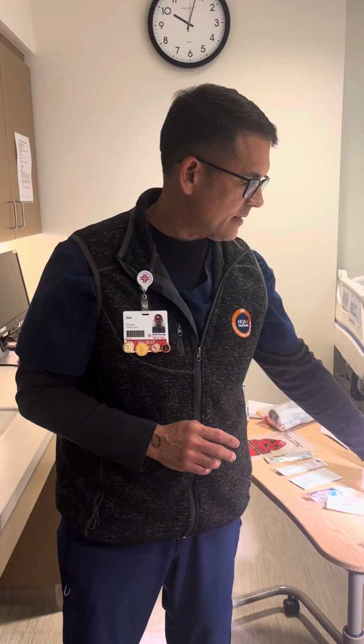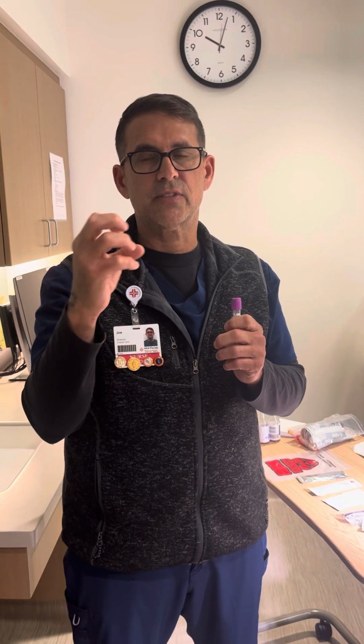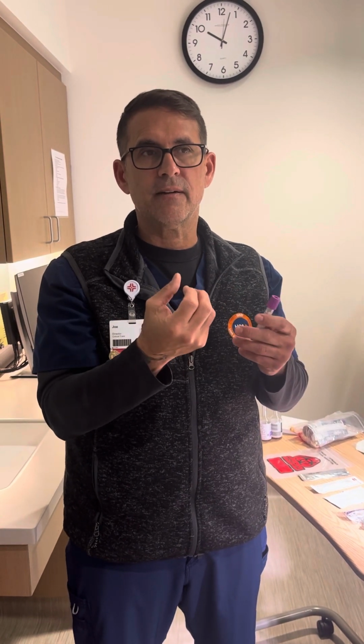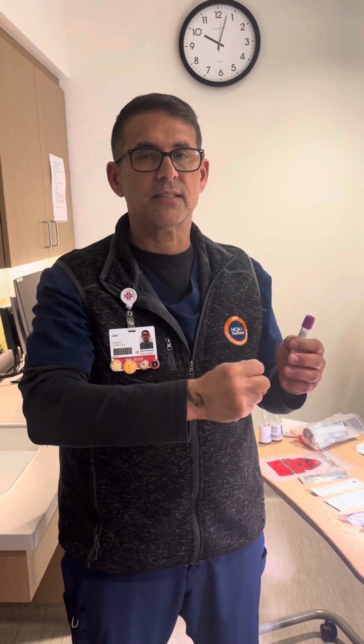And then the other one is clotting. So when you're drawing a CBC, it cannot clot, because now those clots take up a lot of the red blood cells, and when you do the count on the free flowing blood, it's going to be off. If they don't kick back a clotted sample, you're going to have a CBC with a really low H&H, even though it might be normal, because the clots are keeping all those red blood cells in a clot and not measuring it.